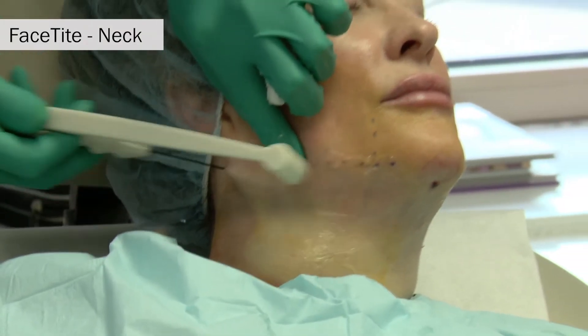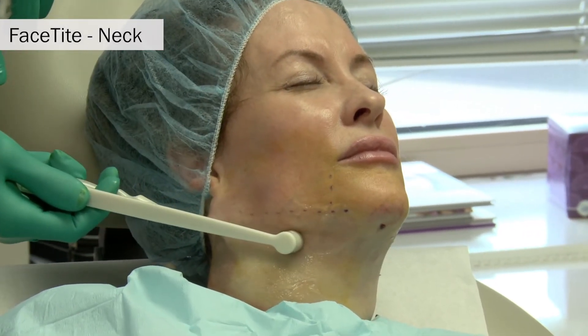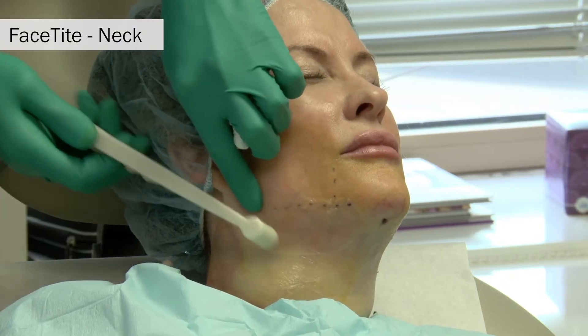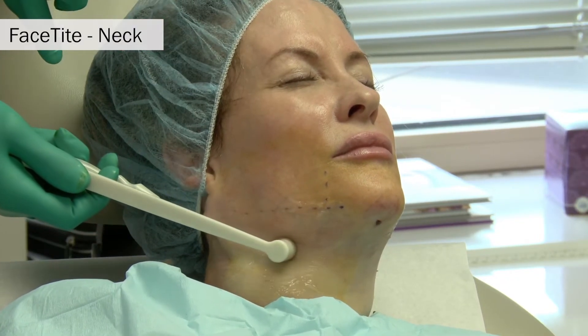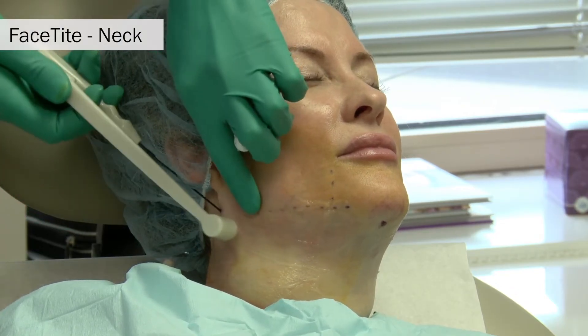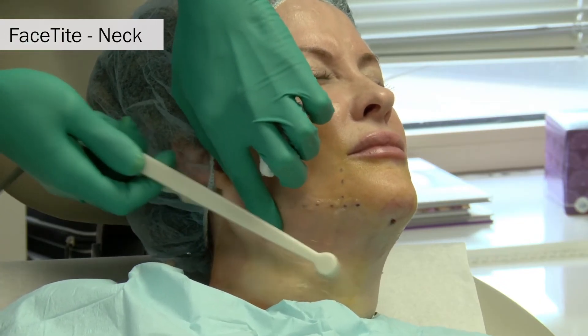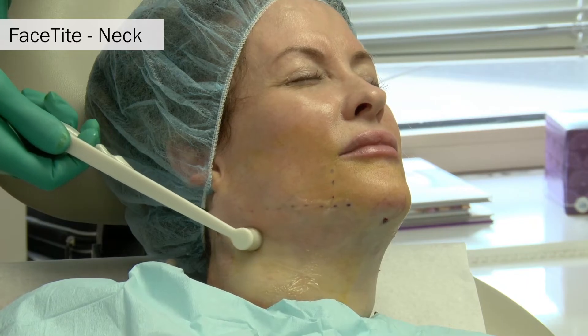Treatment of the lateral necks takes about seven to ten minutes per side, and about three kilojoules of energy is instilled into either side of the neck. We are continuing to radially treat the neck in this pre-platysmal plane while pinching the subcutaneous tissue between the two probes.